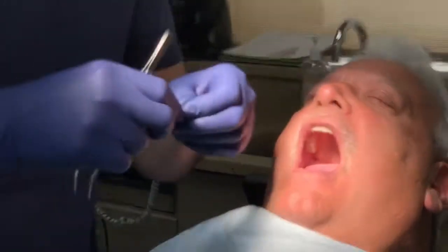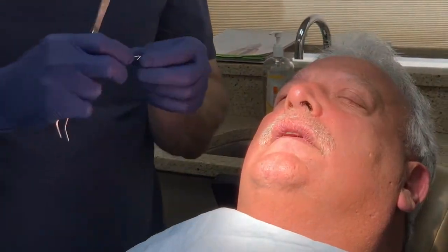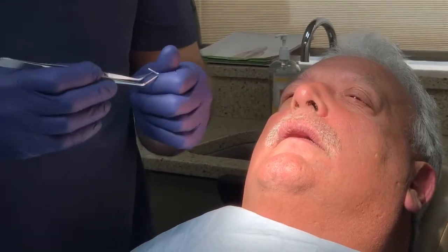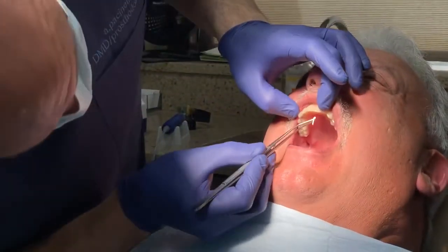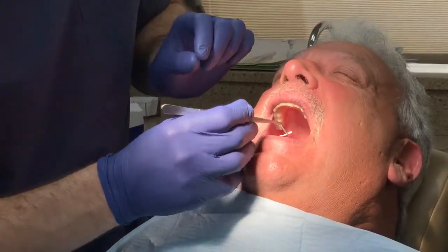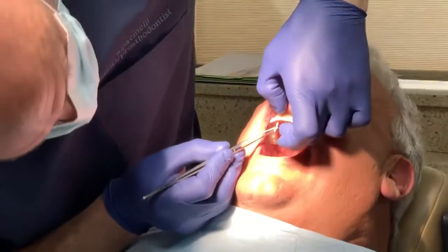If you were going to remove the prosthesis to clean it, because some clinicians do that, then I wouldn't put composite because you have to drill it out. I would put in the same material that I use. But the other thing, if you noticed before, is that I use different color Teflon tape.